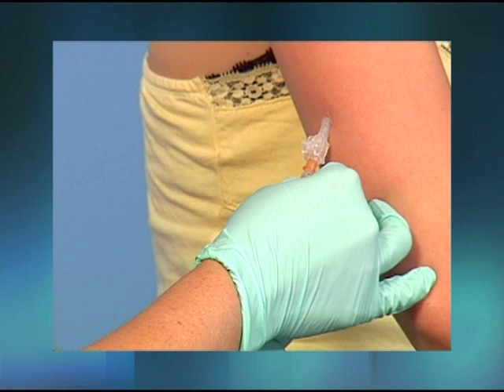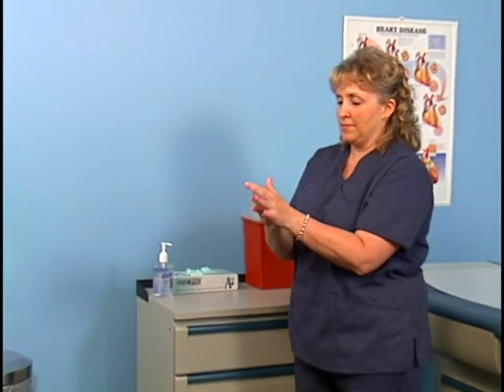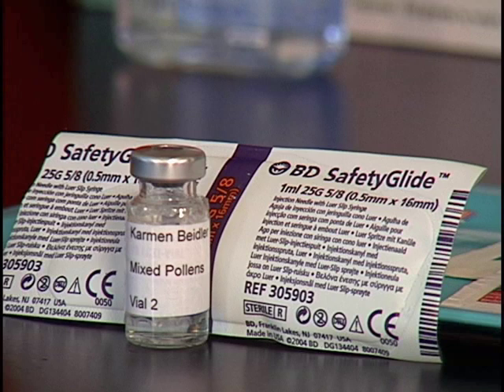The medical assistant will show you how to administer an allergy injection to a patient who is allergic to mixed pollens. Before proceeding, sanitize your hands. Next, prepare the injection. To prepare an allergy injection, you will need the patient's allergy medication, a syringe with small calibrations known as a tuberculin syringe, a needle with a gauge falling between 23 and 25 and a length between 1/2 inch and 5/8 of an inch, and an antiseptic wipe.